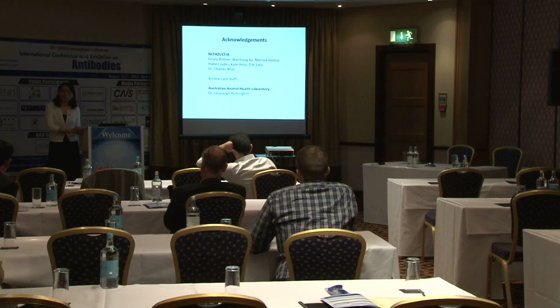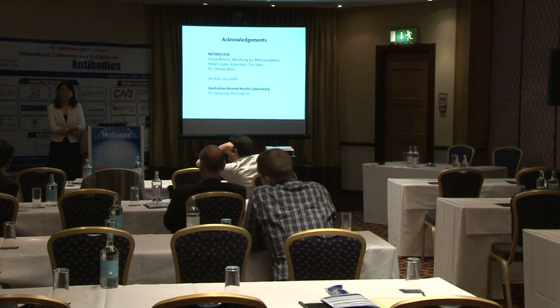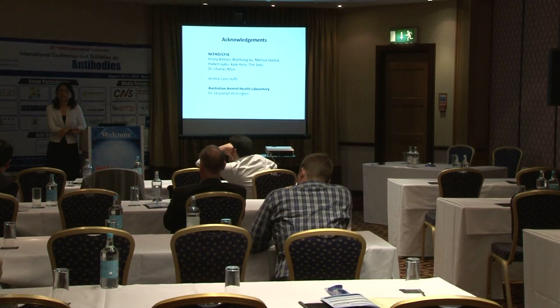Any other questions? I'm wondering, because I'm not familiar with the competitive ELISA, could you not use polyclonal antibodies? Is that why you couldn't use polyclonal? We still can use polyclonal, because for serotype O C ELISA, we use polyclonal, but the problem is always high background. The false positive rate is quite high, and between serotypes we always see lots of cross-reactivity, so we still don't know which serotype the animal is infected with.